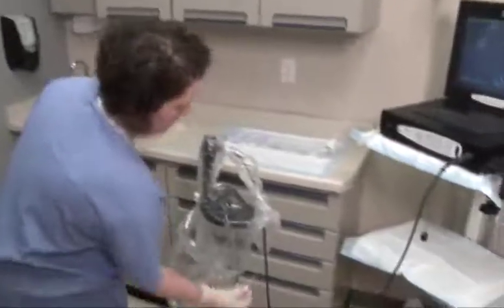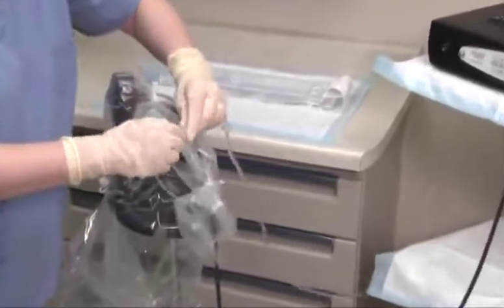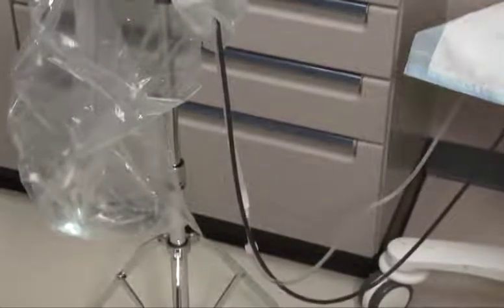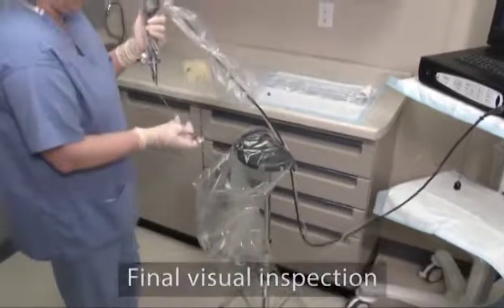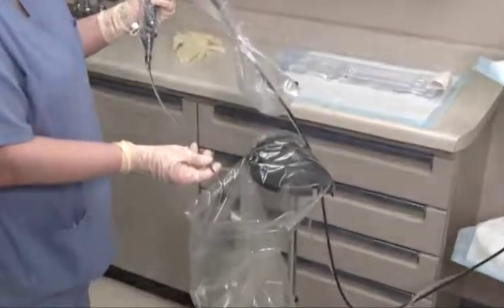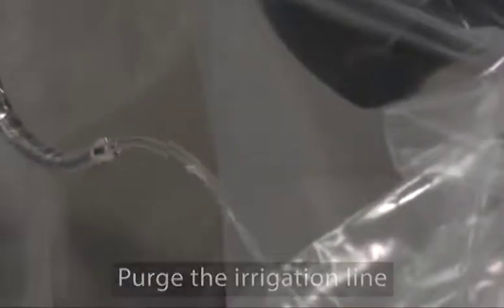Next, remove the cap from the irrigation tubing lure lock and connect a fluid management accessory. Note that fluid withdrawal and irrigation may also be accomplished by connecting to the standard lure lock fitting on the accessory port. The cystoscope is now ready for use. Lift the system out of the installation stand and visually inspect the sheath to make sure that the distal tip of the cystoscope is flush with the sheath window. Activate the flow control valve to ensure proper operation of the fluid irrigation.